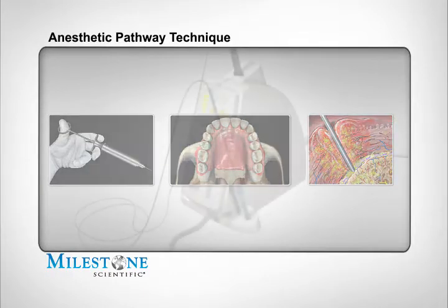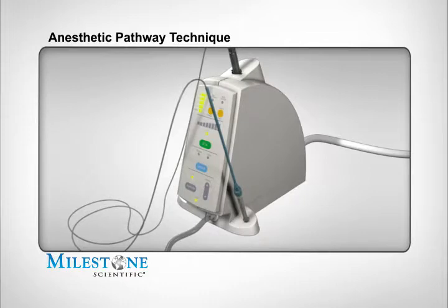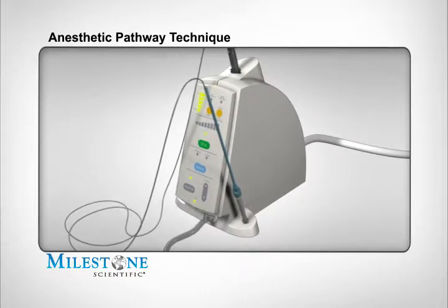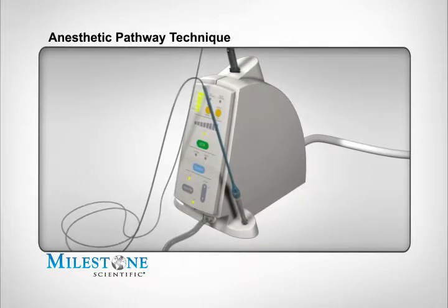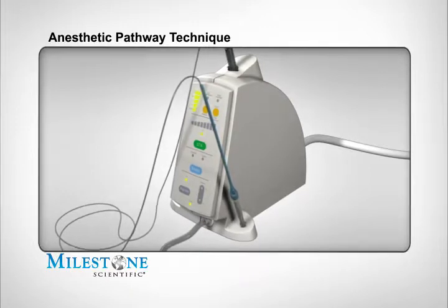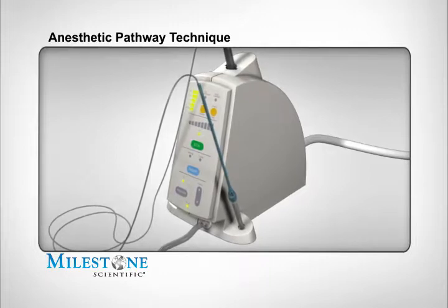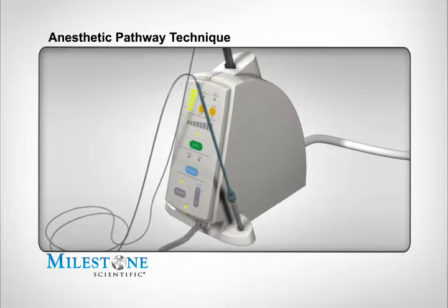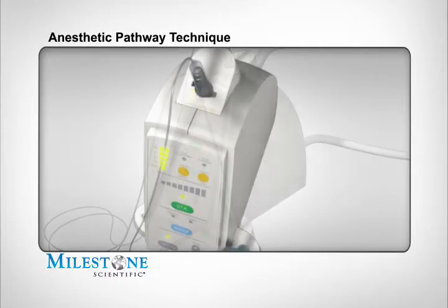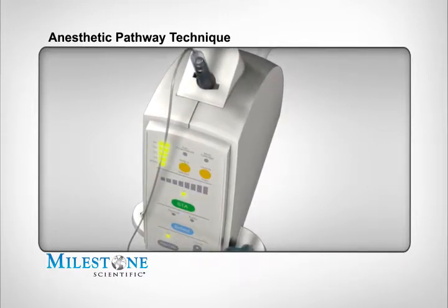With the introduction of computer-controlled local anesthetic delivery systems, Dr. Mark Hochman and colleagues at Milestone Scientific developed the pre-puncture technique, allowing painless palatal injections to be performed when using the wand STA system. This technique consists of a series of specific steps that will result in a superior outcome that just cannot be replicated when using the manual syringe that was developed over 150 years ago.